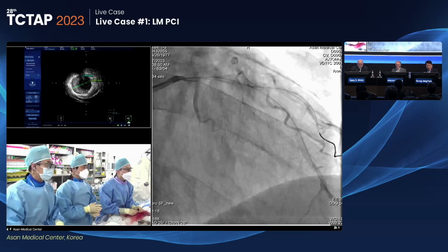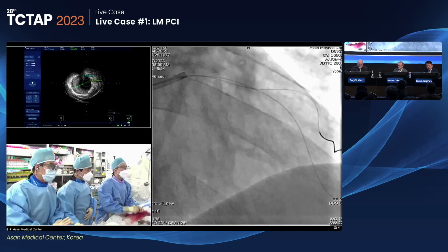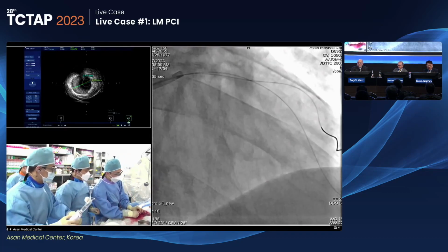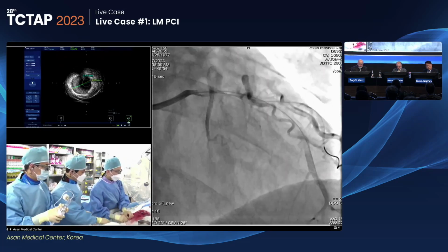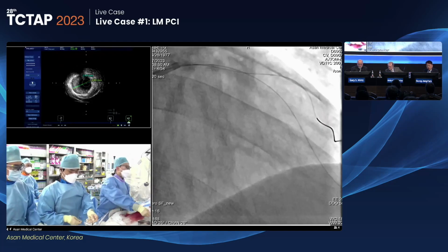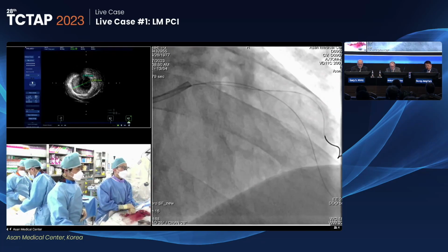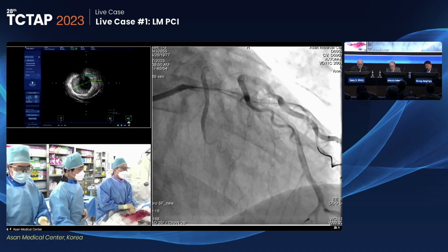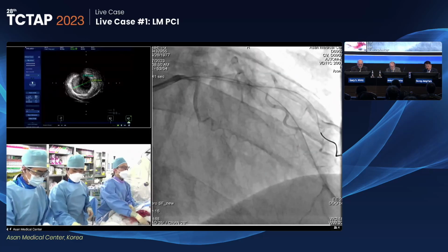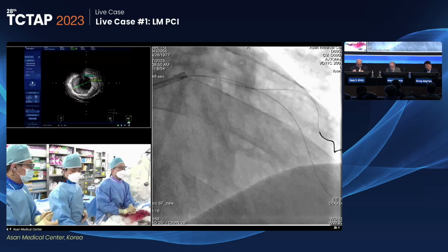What about changing to a little bit stiffer wires for the diagonal branches, and rearranging the guide wire? Also a little bit stiffer wire may be helpful for something. The LAD will be fine if you take that wire out, won't it? So just take the LAD wire out to deliver your stent. Change the geography. It's an alignment issue, isn't it?